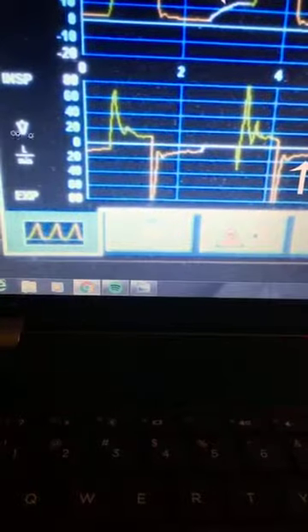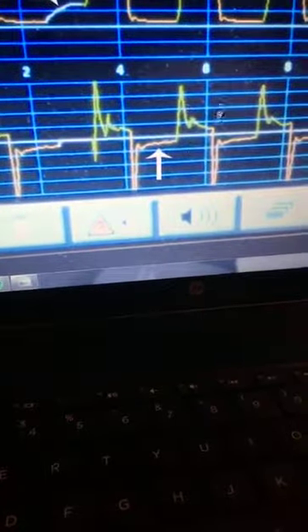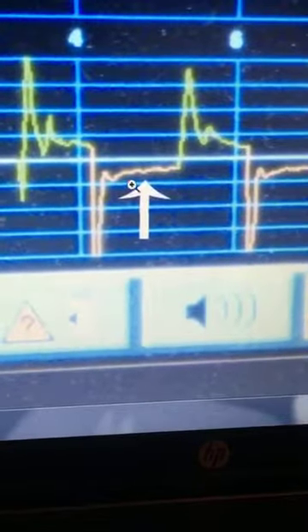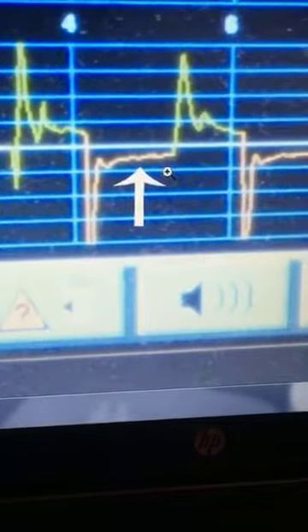Now that we've learned how to use ventilator graphics to determine if there's a leak, we'll take a look at the opposite problem, air trapping, or auto PEEP. Staying with our flow by time scalar here, you can see on this breath that the flow never returns to baseline before the next breath is initiated. Remember, this line here represents the patient's exhalation flow. So the patient wasn't done breathing out before this breath started. That's an example of air trapping or auto PEEP.